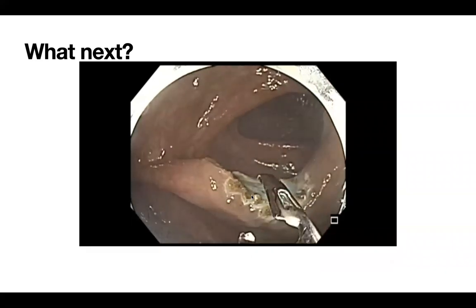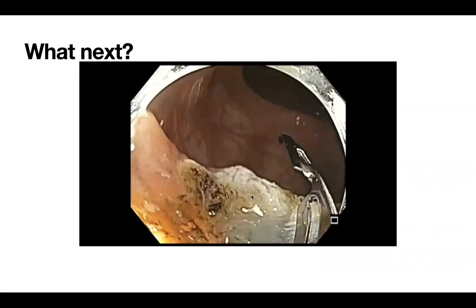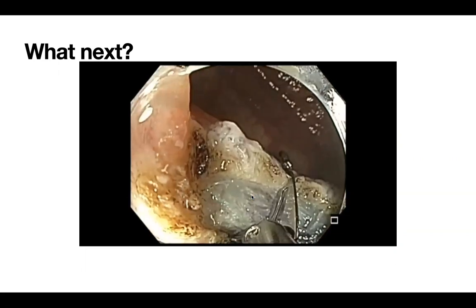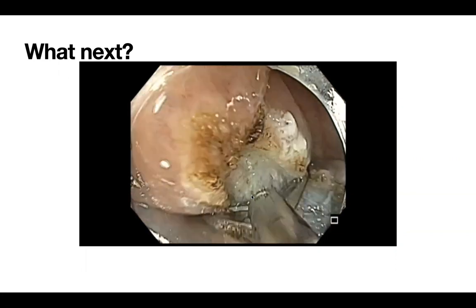So we decided to close the defect. I truly believe that if you close it right, you do cut down the risk of delayed complications.